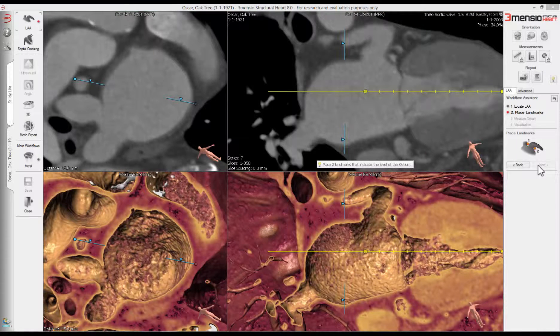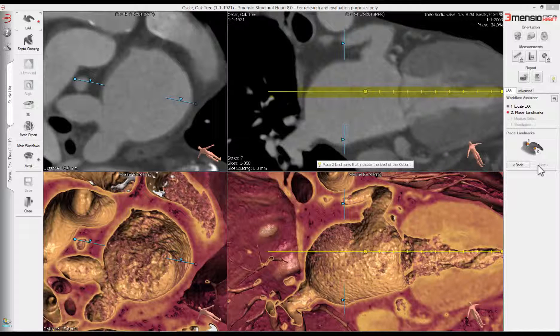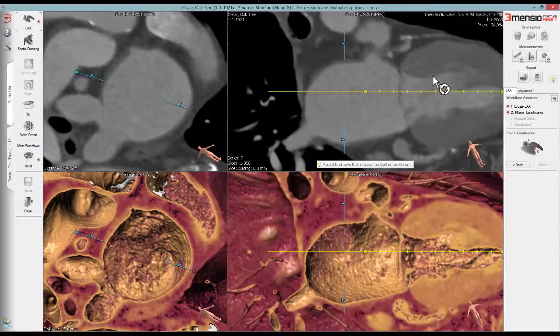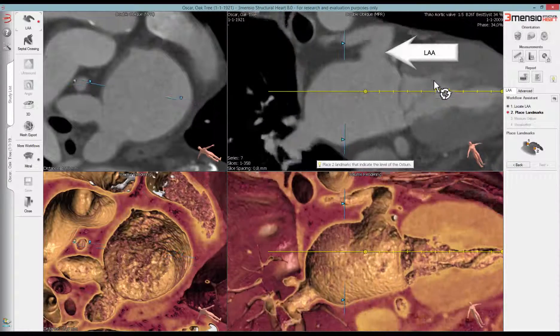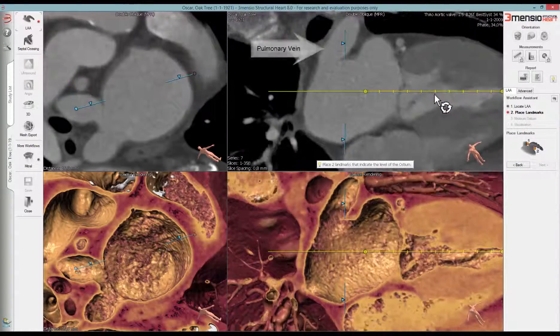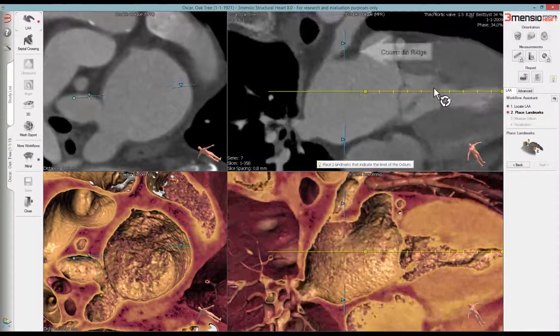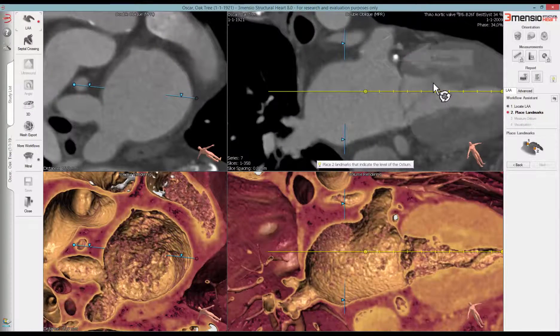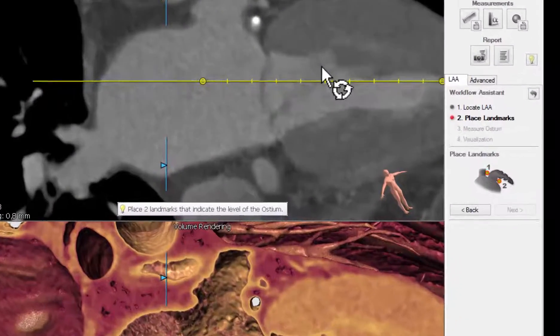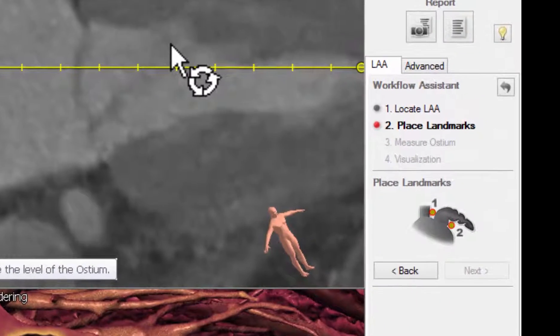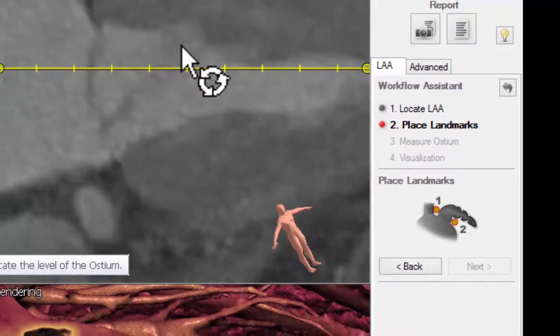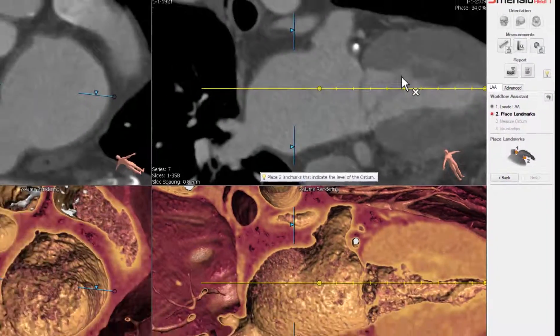On the right top view, a left ventricle line is shown running from the apex to the left atrium. Hold the left mouse button to rotate this view. When we do this, we have an excellent view of the LAA, pulmonary vein, coumadin ridge, and the circumflex. In this step, we will place an initial LAA ring by placing two landmarks — one on the coumadin ridge and one on the circumflex.